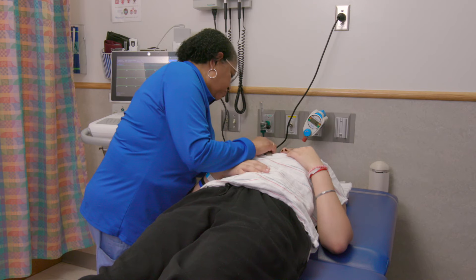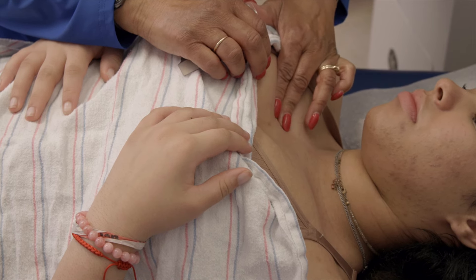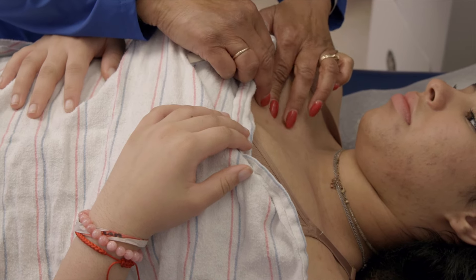What I'm going to do here — this is your collarbone, and I'm just feeling your ribs to make sure I get the right spot, okay? So, first rib.